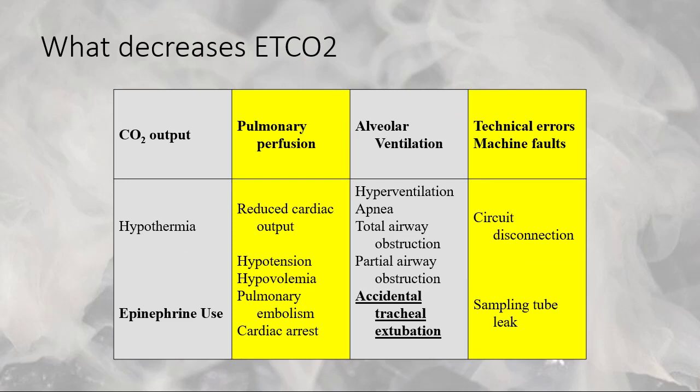Now, this is a misnomer. I'm going to point this out. It is true that epinephrine has an effect and will drop your End-Tidal CO2. It's not so much decreased CO2 output. It's that it constricts. There is some documentation that large amounts of epinephrine, consistent with the amounts we give in cardiac arrest, will possibly cause what we call stone heart syndrome, which will transiently, for a few beats, affect how well the heart or compressions is pushing cardiac output, and will also cause vasoconstriction of the pulmonary capillary bed, which of course would decrease CO2 transferring across into the alveolar space.